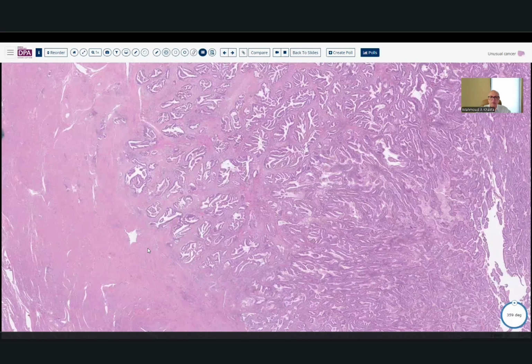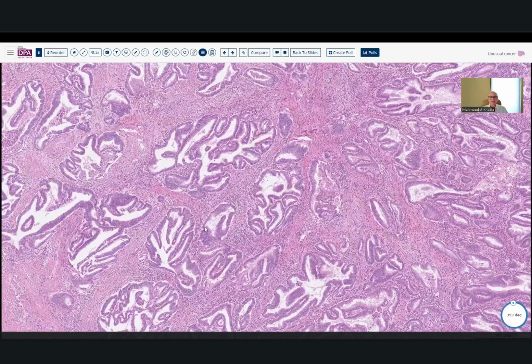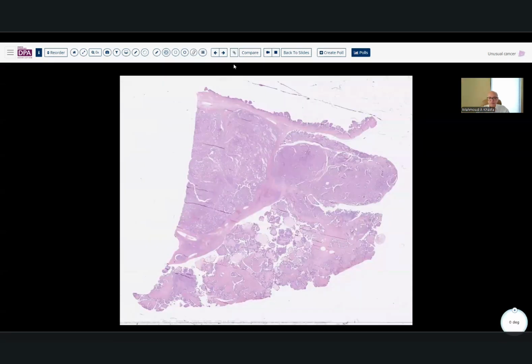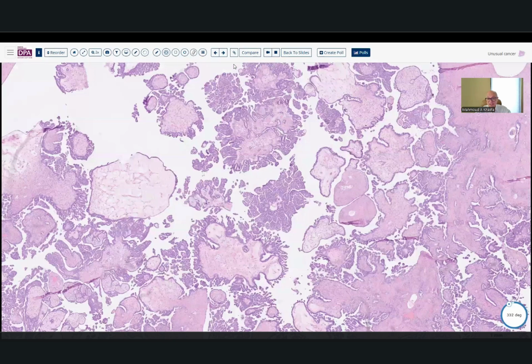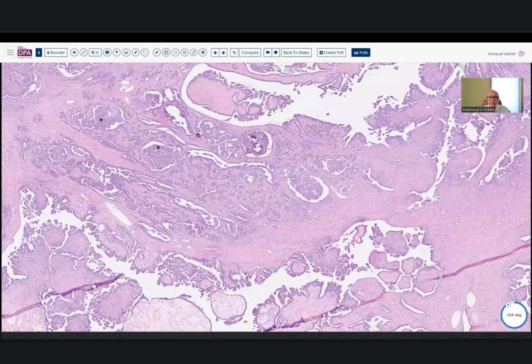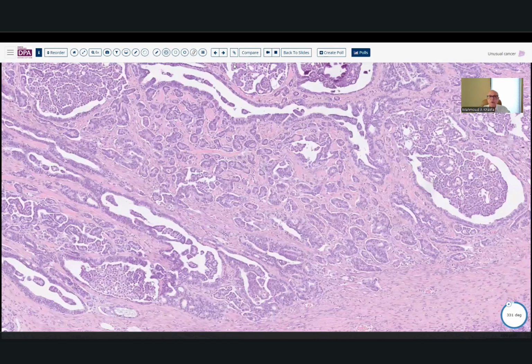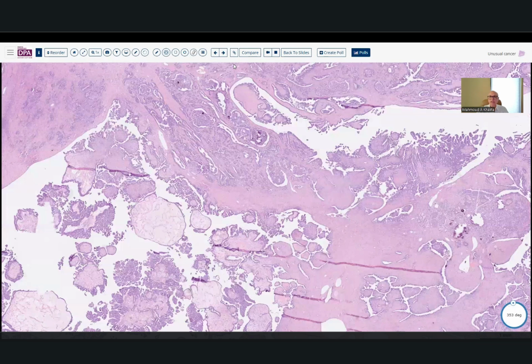And here is the hysterectomy. I think the hysterectomy is straightforward, FIGO1, no problem. Everyone will agree that this is a FIGO1 endometrioid cancer. The surprise was in the ovary. Here's the ovary. The ovary had a tumor that looks like serous, and you think this would be a borderline serous tumor. But when you get here in this area, I think this is invasion. So this will be a good example of a previously undiagnosed low-grade serous carcinoma.